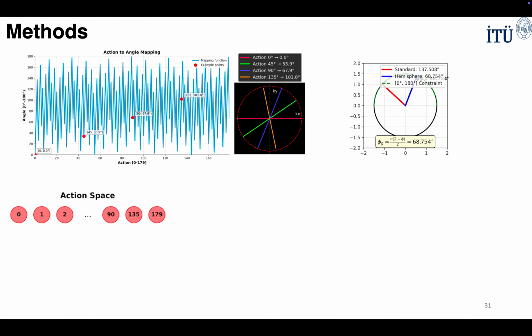Our angle generation process uses a Golden ratio-based approach. Starting from a base angle, we apply the Golden ratio to ensure uniform k-space coverage. This mathematical relationship, phi_n, creates optimal angular distribution. The bottom visualization shows how different trajectories evolve over time.